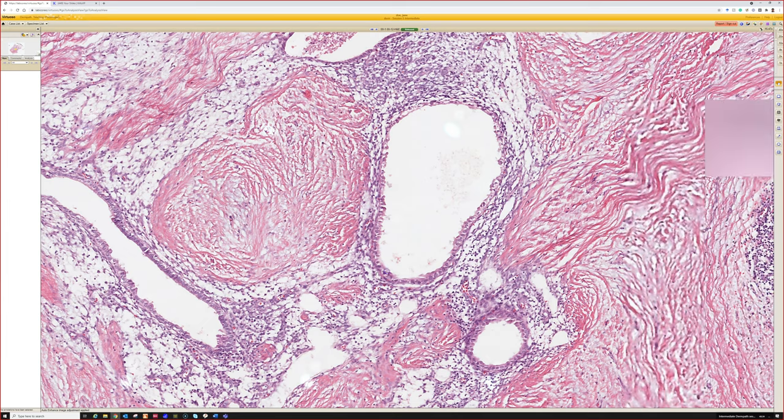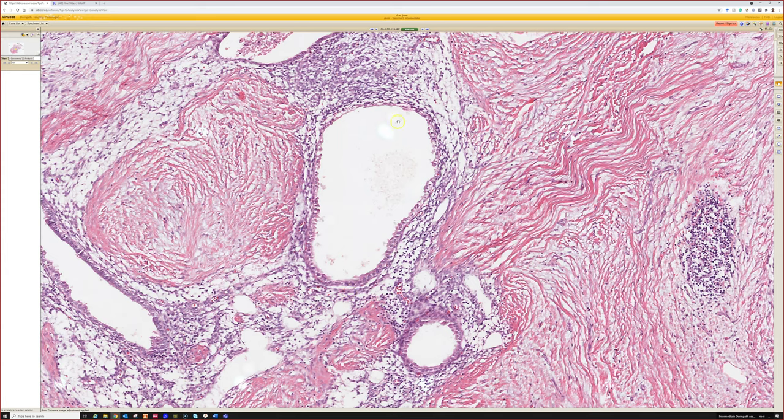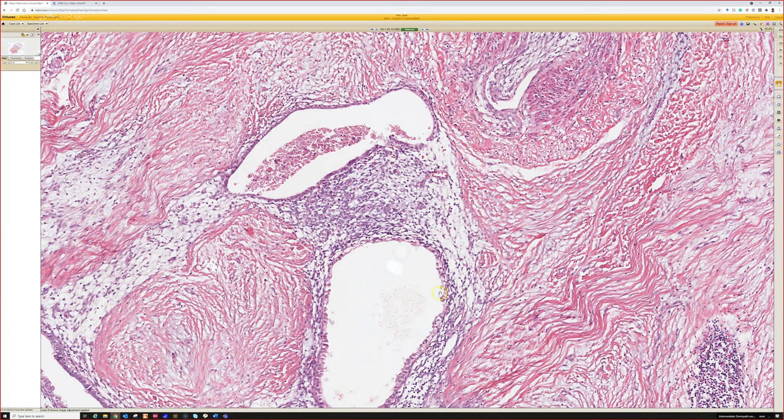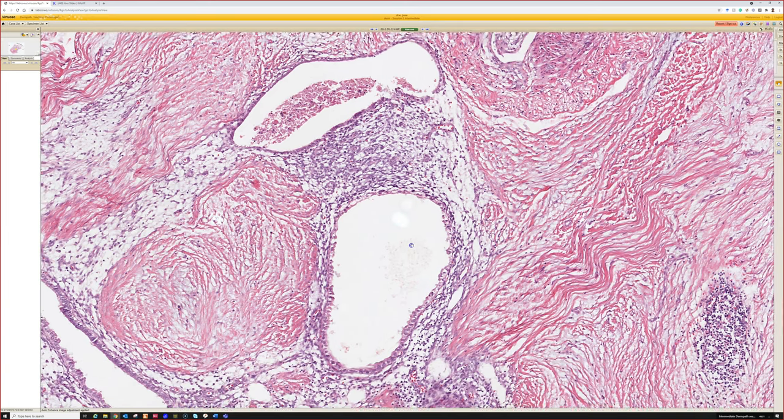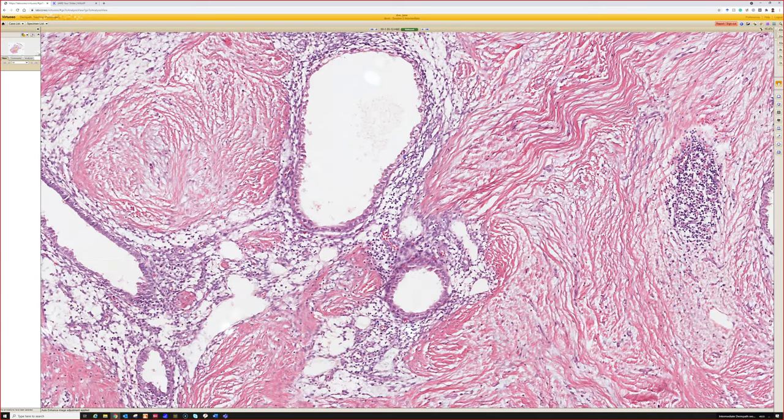Yeah, very good. So when you're down in deep soft tissue and you see gland spaces or cystic spaces that are lined by a layer of epithelial cells, one thing you have to think of is, could it be metastatic carcinoma, right? Because you shouldn't have glands down in deep soft tissue. But the one really important mimic to not miss is endometriosis, which, if you're having a bad day, can get mistaken for metastatic carcinoma potentially.